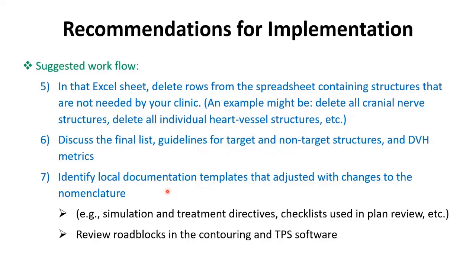That adjusted with the changes to the nomenclature. Example, simulation and treatment directives, checklist used in the plan review, etc. Review roadblocks in the contouring and TPS system.